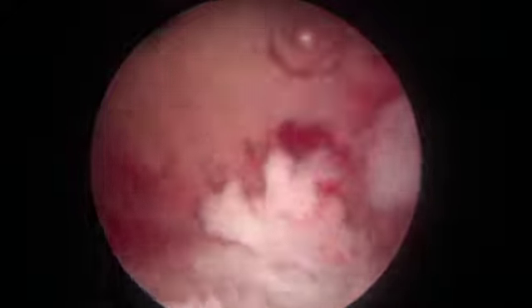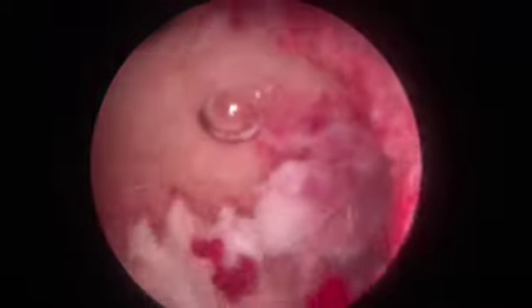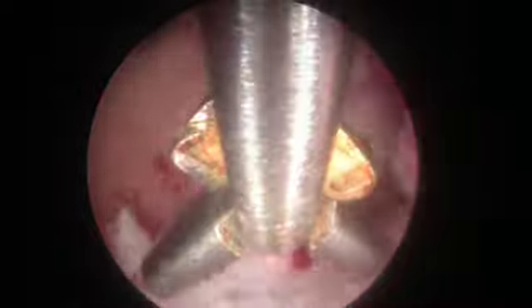Once the entire tissue is off, we will be introducing the grasper. This might consume a little amount of time. We are working with an endomat with a pressure of just 100 mmHg and 200 ml per minute drip rate. Now you can see all the tissue being elevated, and gradually with the help of the grasper, one or two times, we will be removing it completely as we take a biopsy.